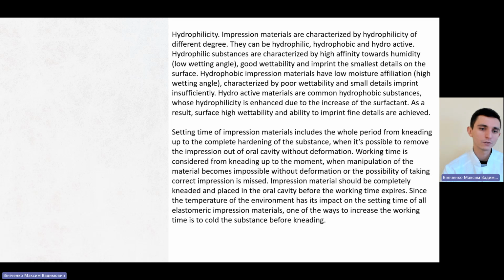Setting time of impression materials includes the whole period from kneading up to the complete hardening of the substance, when it's possible to remove the impression out of the oral cavity without deformation. Working time is considered from kneading up to the moment when manipulation of the material becomes impossible without deformation, and the possibility of taking a correct impression is missed. Impression material should be completely kneaded and placed in the oral cavity before the working time expires.